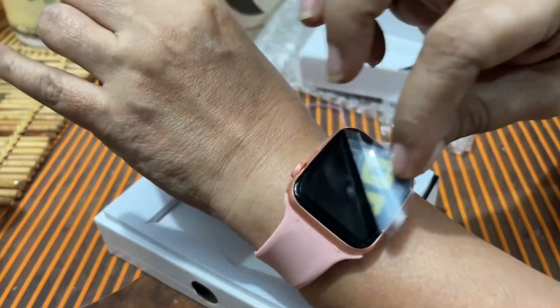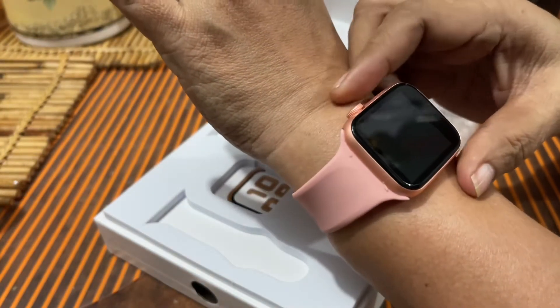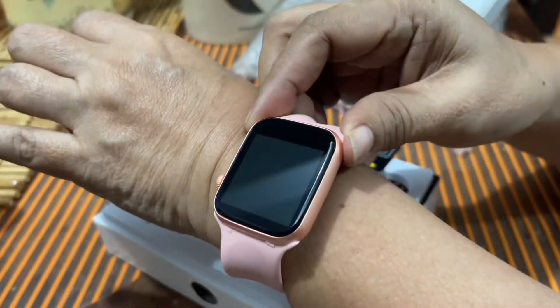I tried it, and then tinanggal ko yung plastic — o-on ko sana siya. Pero wala palang charge ang battery. So mamaya, tetesting ko ulit siya.